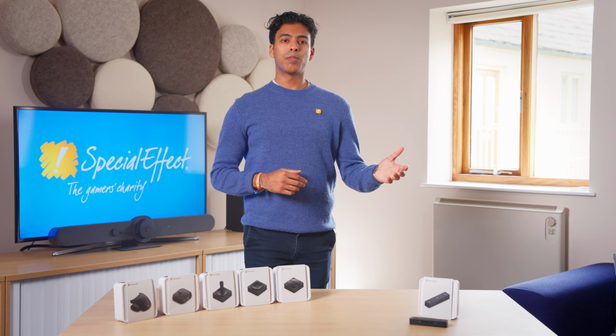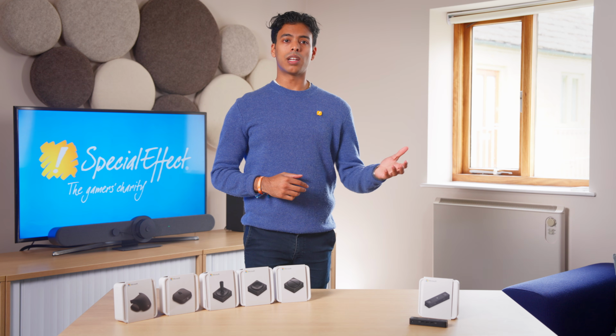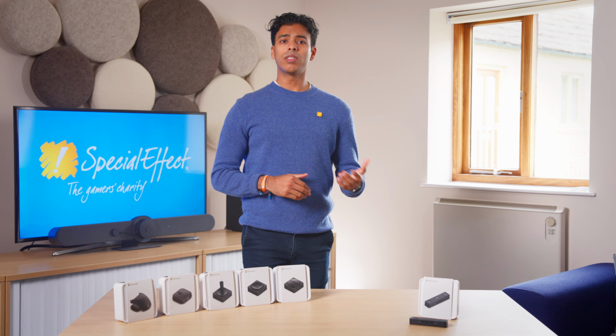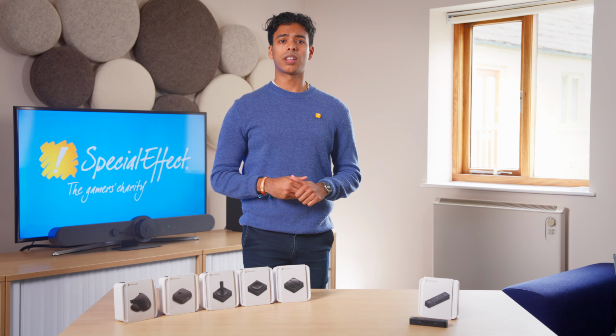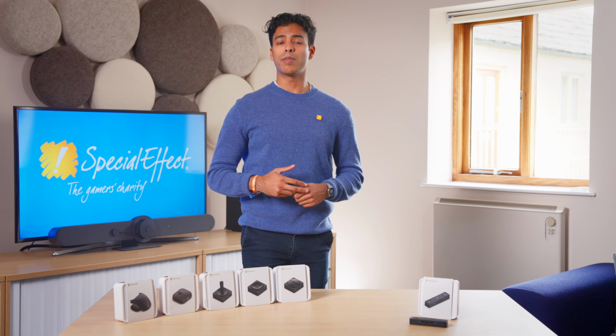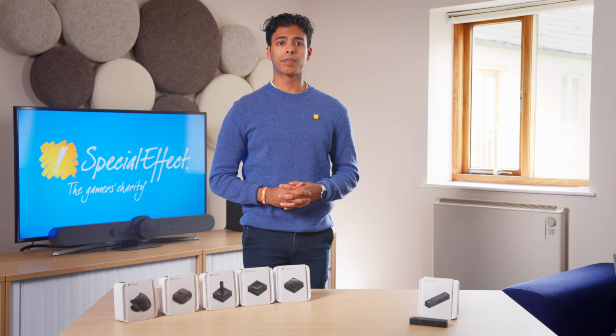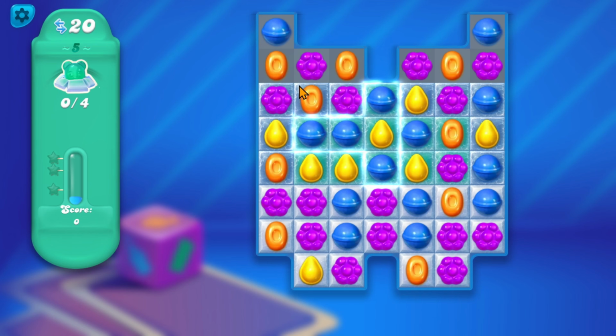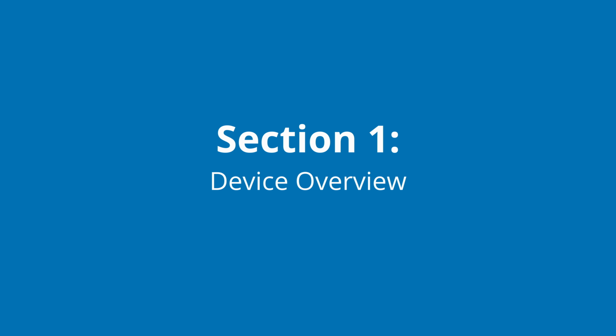The Microsoft Adaptive Hub is a switch interface that does allow for these types of inputs that are needed for playing video games. Throughout this video, we're going to have an in-depth look into the interface and how it can be used to connect accessibility switches for gaming on a Windows PC. We will look at some of its features such as creating and swapping between profiles, using macros, and mouse movement options.